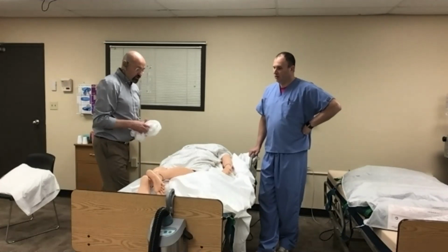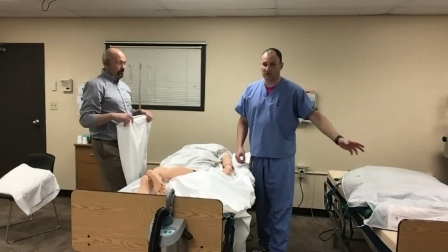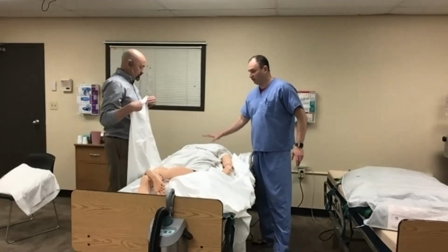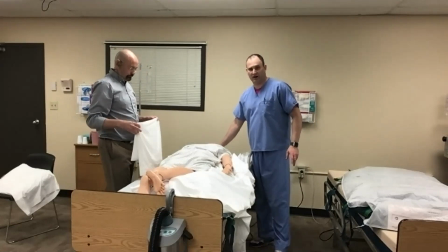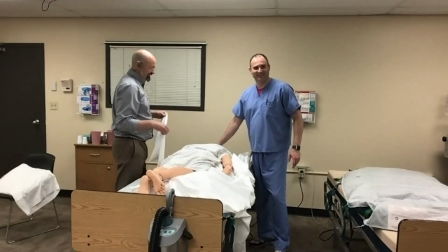We can now supine him. And that second surface doesn't have to be another bed. It most likely will be a stretcher. And realize too that throughout all of this, there's somebody managing his head and his hair and his airway. He doesn't have hair. His airway.